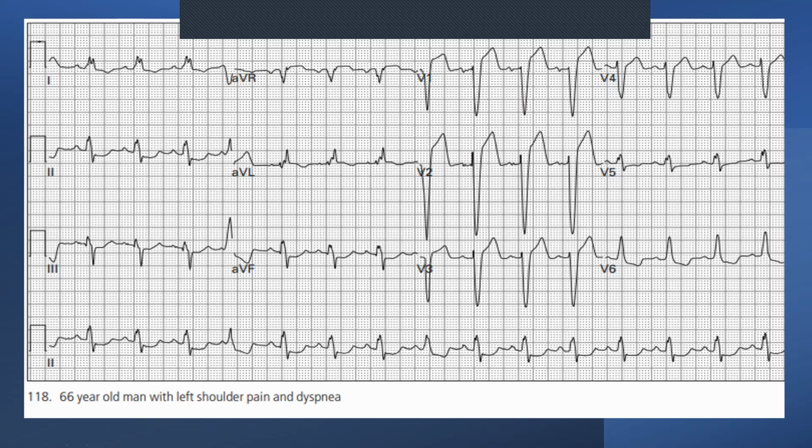Now, in a patient who's, for example, not being seen by your hospital, clinic, or practice, they've been in another state, province, or country, and they have no idea, they just know they've had ECGs before. If you were to see something like this and they presented with signs, and you were to manage them as an acute MI, medico-legally you are covered because you're following the norms and standards of the medical community. However, if a patient comes in with a history of left bundle branch block, no acute symptoms, and you still treat them as an MI, and then something goes wrong, you are then liable. So that's why we need to know about it.